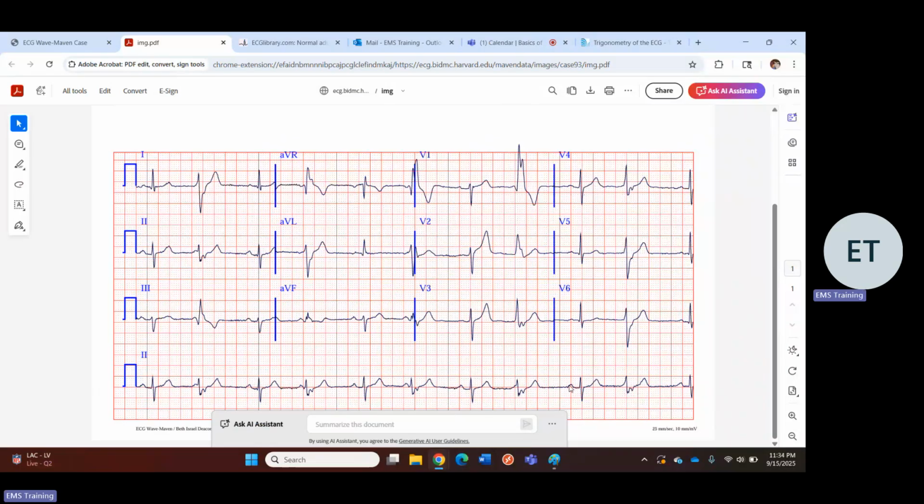So that's a P wave though. These are all P waves. So, oh wait, but look at that. The PR interval is different. Aha, look at that. The PR interval looks okay here, looks okay here, maybe a little bit prolonged actually, but then it's short. And then it's followed immediately by this other thing. Why does it look like that?